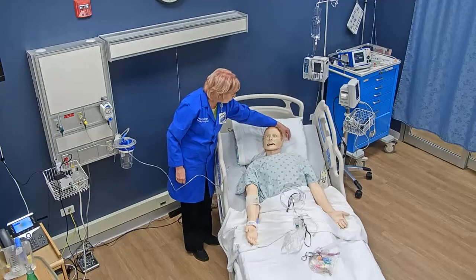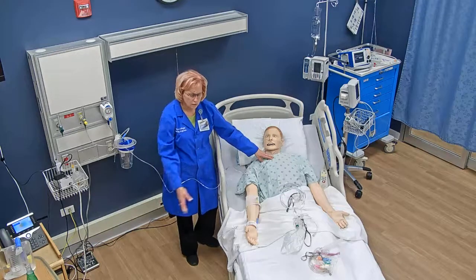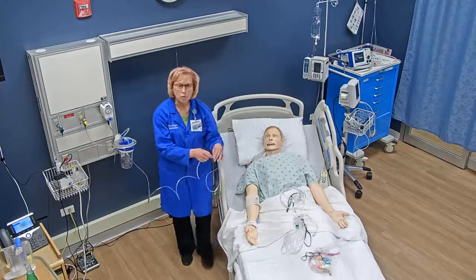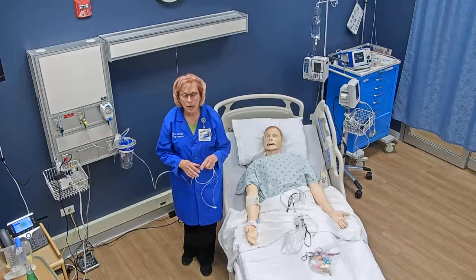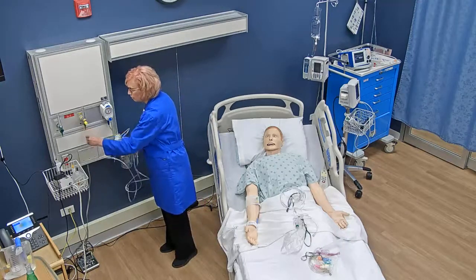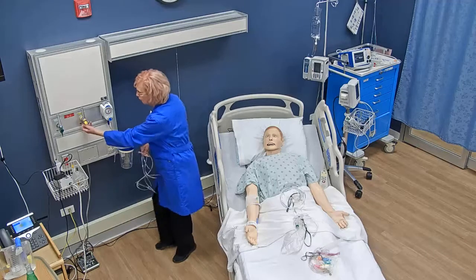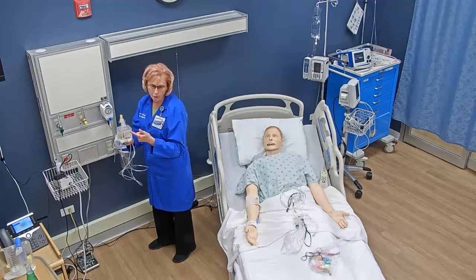As soon as this is in place, only a minute or so later I'm going to check the patient's oxygen saturation and see if it's coming up with the oxygen on. Now, if I'm administering oxygen at three liters a minute or more, or for an extended period of time, or the patient has complained about a dry nose, I may need to use a humidifier. Instead of using the adapter, I would attach the humidifier.